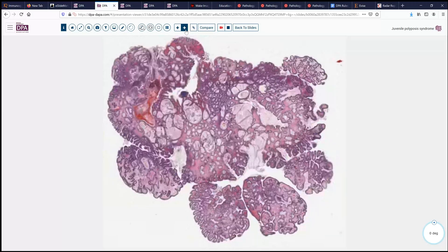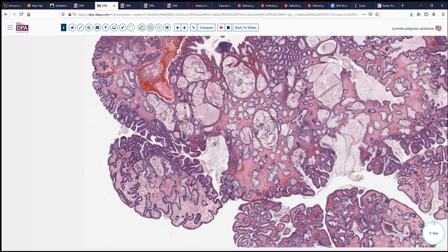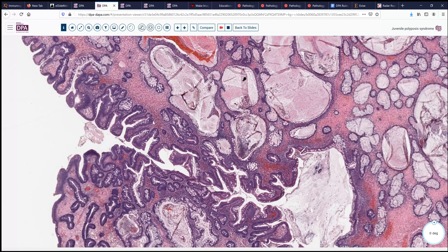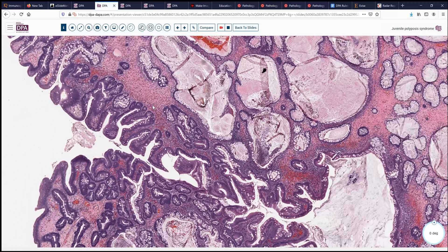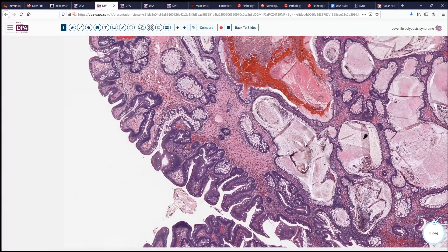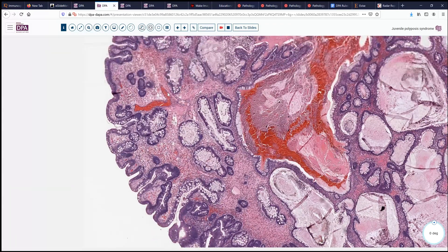Here is another nice example of a juvenile polyp. Deep glandular dilatations with somewhat complex mucosa, but benign — similar to what we would see elsewhere in the colon — and stroma pretty much devoid of smooth muscle. Normal stromal elements in terms of inflammation, vessels, and some loose fibromyxoid tissue.